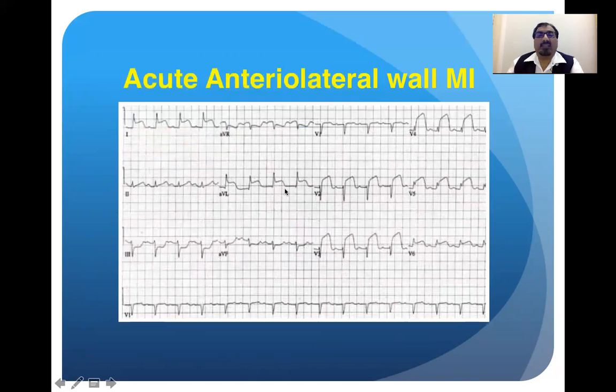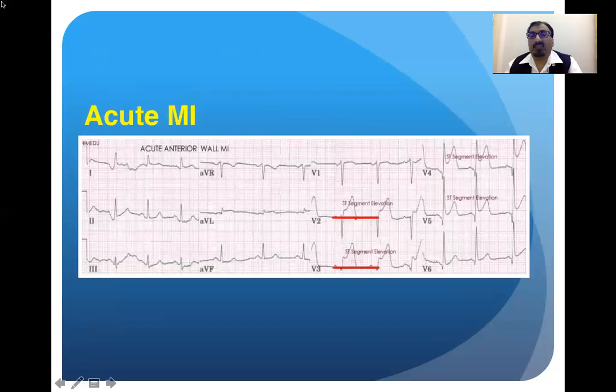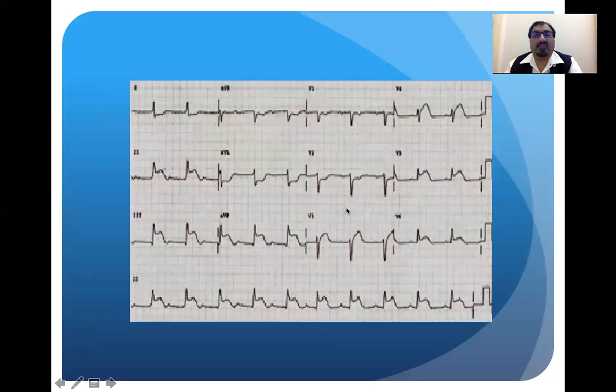Acute anterolateral MI, again ST elevation. You can see that these changes are slightly different from each other, but all these things are representing different stages in which these coronary arteries are being seen. If you look at this one particular acute MI, it's an extensive MI. Again, you find that the ST segment is going up, right? But it is coving upwards. So you can see that the changes are slightly different from each other, but still representing the same LAD or LCX or right coronary involvement.